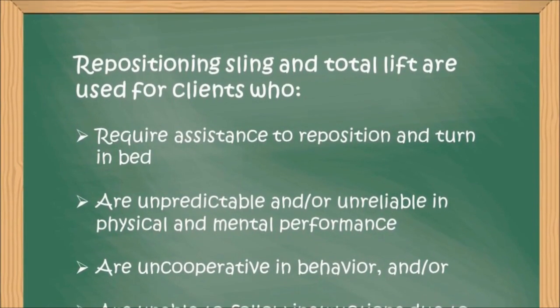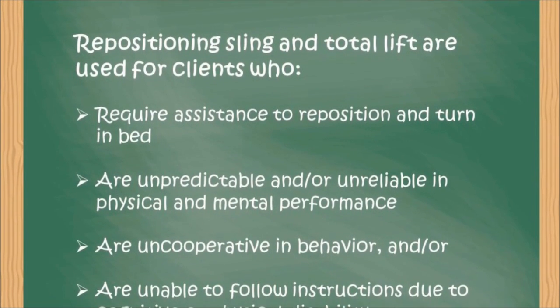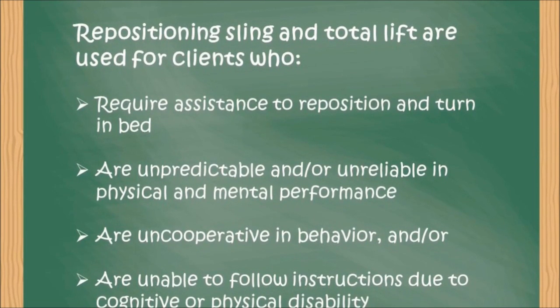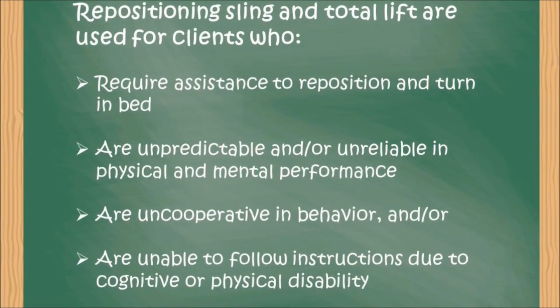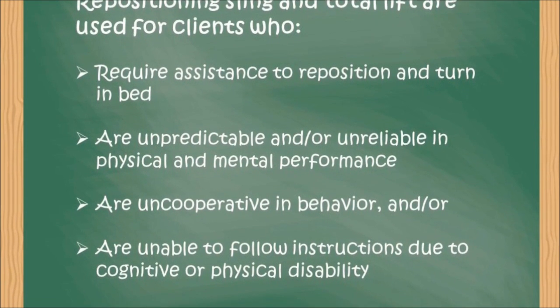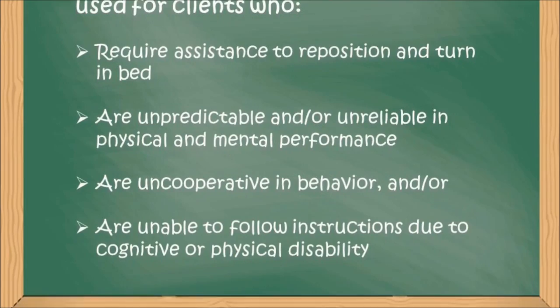The repositioning sling and total lift are used for clients who require assistance to reposition and turn in bed, are unpredictable and or unreliable in physical and mental performance, are uncooperative in behavior, and or unable to follow instructions due to cognitive or physical disability.